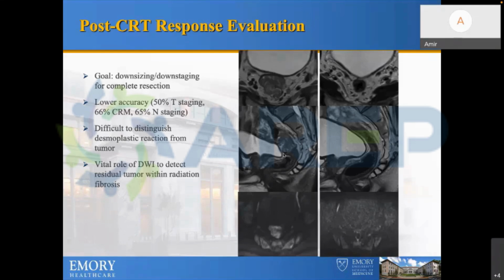You mentioned the rectal gel. Is it the same as ultrasound gel, or any gel we can use? Is there a specific rectal gel that you use? Actually, that's a good question. Early on, when we started doing this, we didn't know if the gas bubbles inside the ultrasound gel might intervene or cause artifact, but actually it doesn't. It's just the expense, whatever is less expensive that you use here.